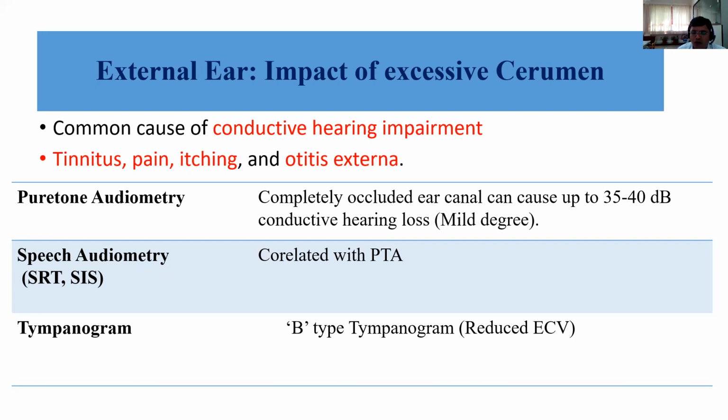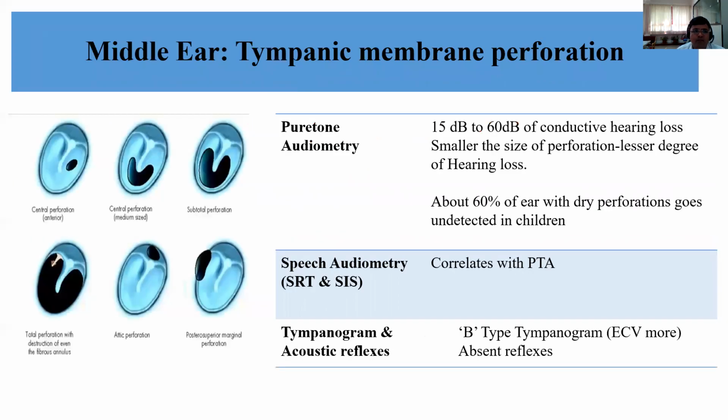So the ear canal volume of that particular individual will be significantly lesser in comparison to the normatives of that group of individuals, I mean, pediatric or adult.